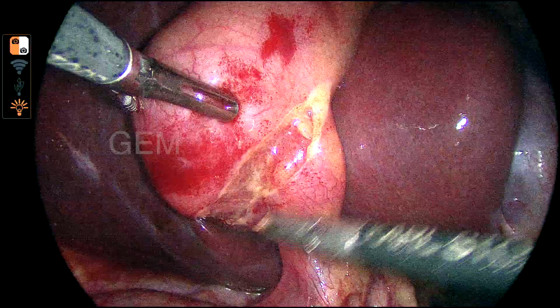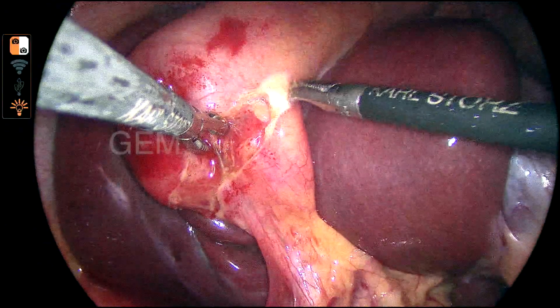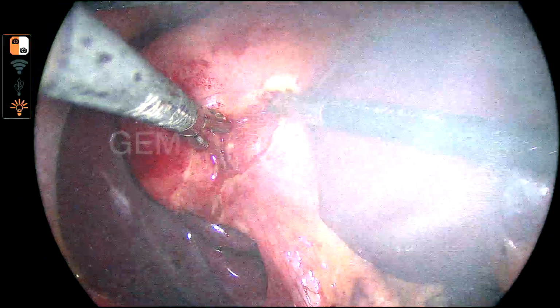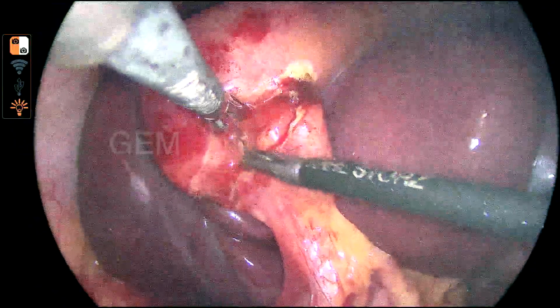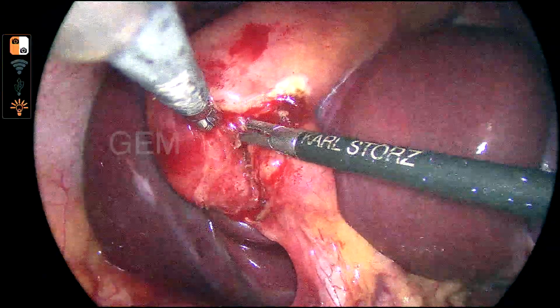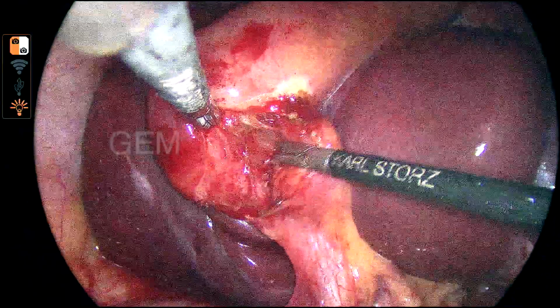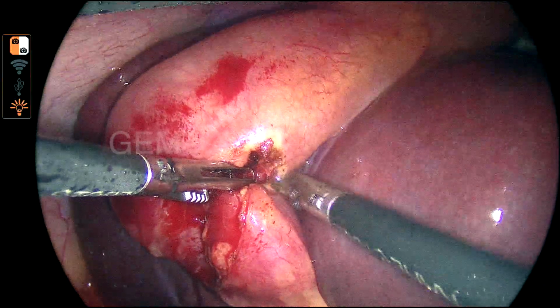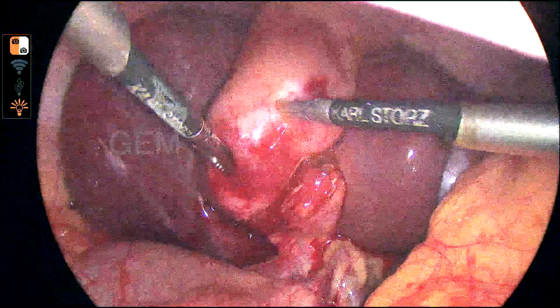So, what I did, I just pushed on the gallbladder. I exposed the anterior Calot's, and I am not able to make a peritoneal incision posteriorly because the exposure is not good. I would have to decompress the gallbladder so that I can see posteriorly. In this case there is no need, I am not decompressing it, because usually when traction of the gallbladder is not possible, then we go for decompression of the gallbladder initially. Otherwise, we can manage with some other maneuver and then proceed.